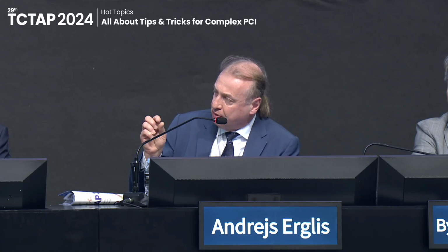Because we also use those balloons, but the question is usually about balloon size. How do you adjust the size, and do you think we should go for a bit smaller balloon and higher atmospheres, or try to go medium to medium? I think the worst thing you can do is to size the balloon too big, right? Some recommend 1:1, but if you're a little bit more conservative, 0.75 is okay.